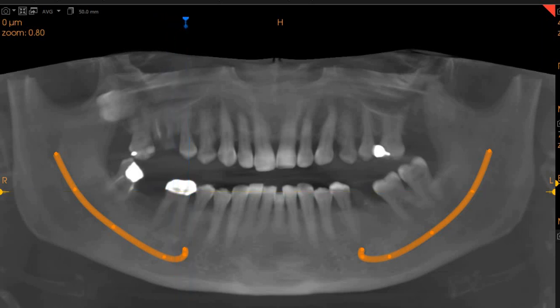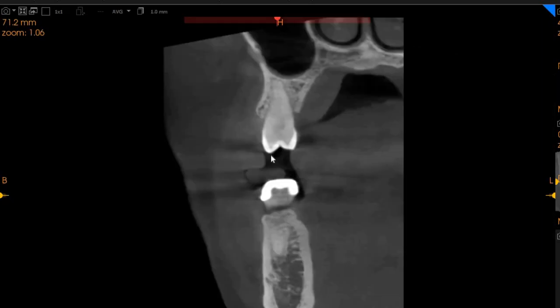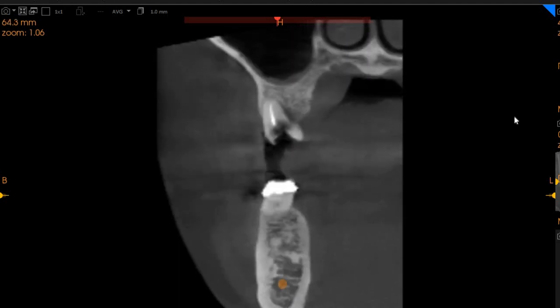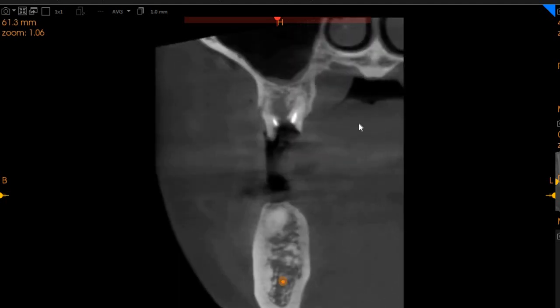You can see the upper right 5 is a non-carious tooth. You've got a little bit of periodontal disease with PDL widening and slight bone loss, but other than that the tooth is unremarkable.